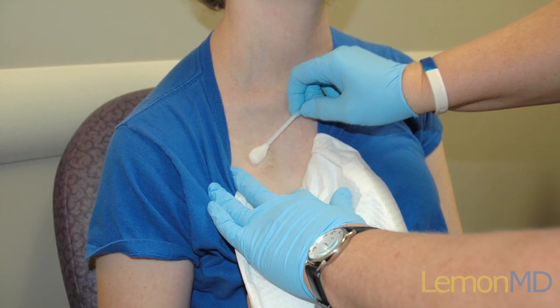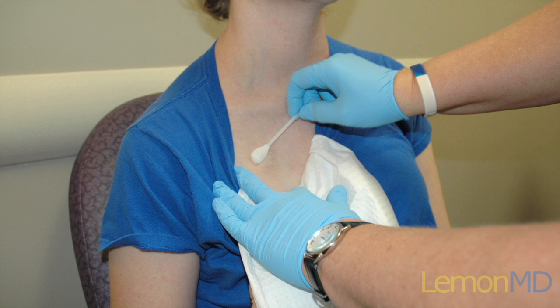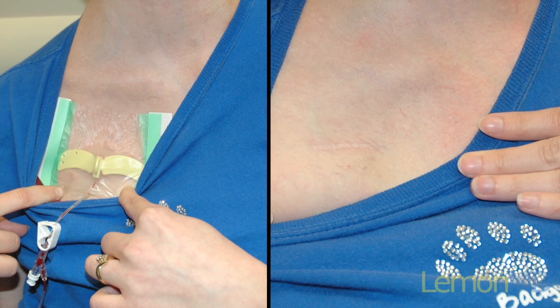Once a patient's cancer treatment is completed and they no longer require chemotherapy, the portocath can be removed as a simple outpatient procedure.